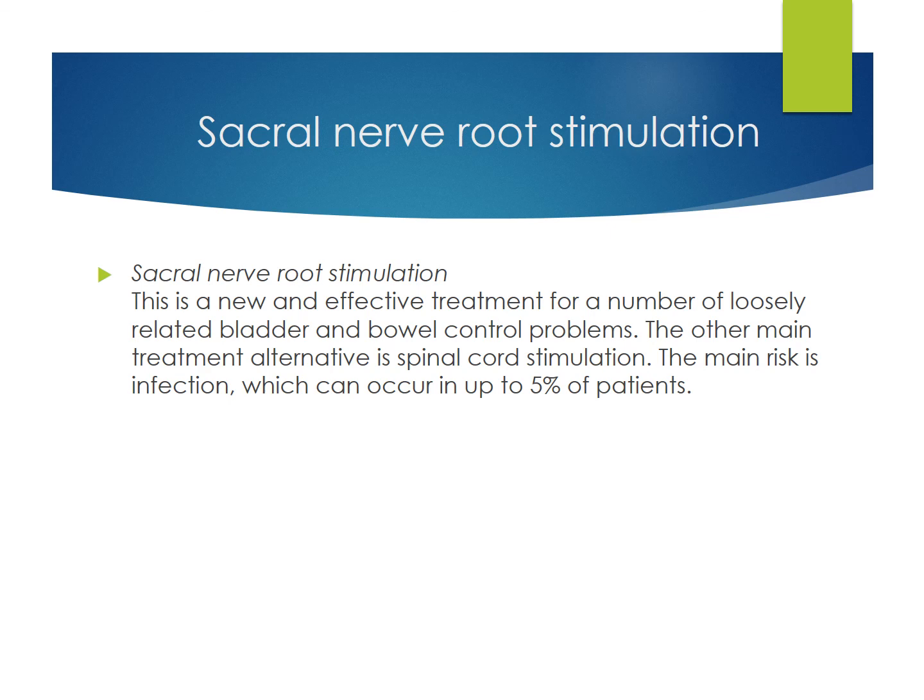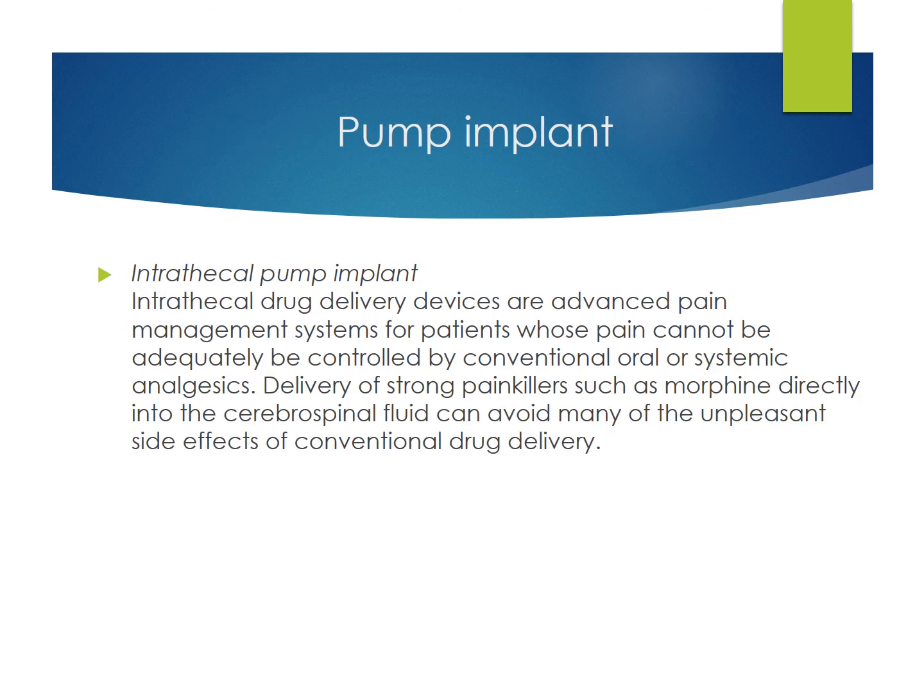Sacral nerve root stimulation. This is a new and effective treatment for a number of loosely related bladder and bowel control problems. The other main treatment alternative is spinal cord stimulation. The main risk is infection, which occurs in up to 5% of patients.